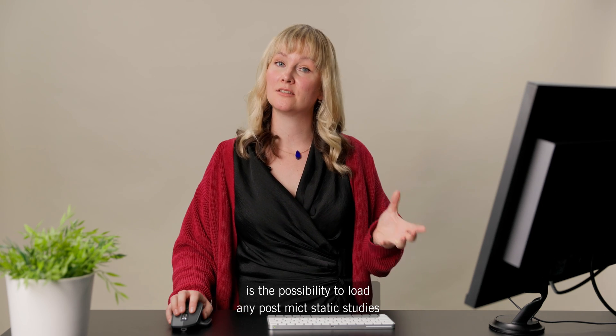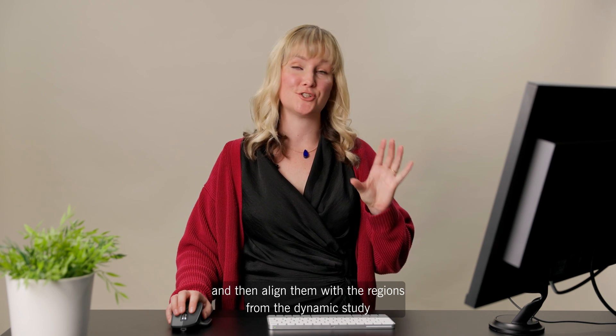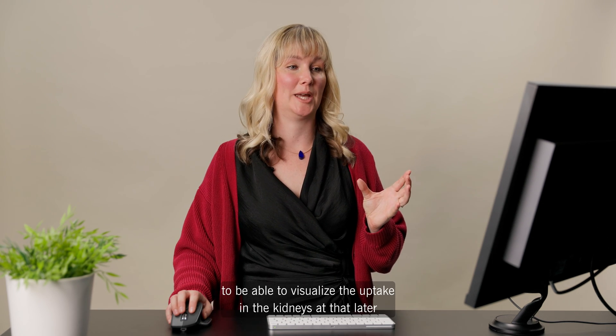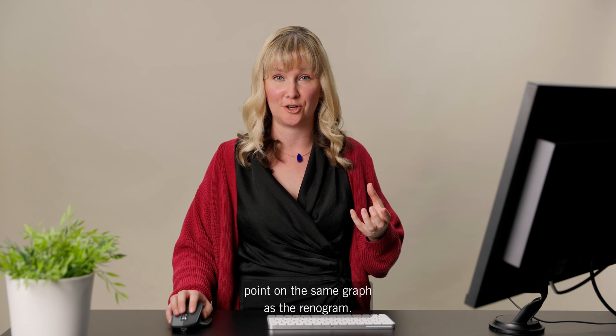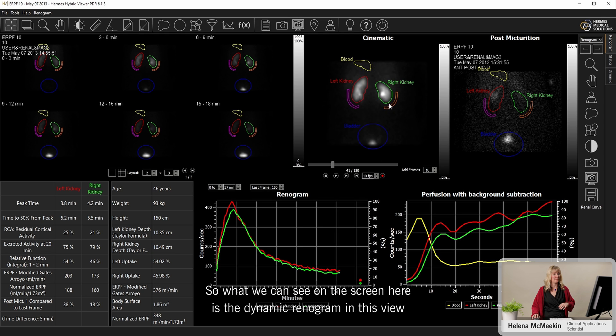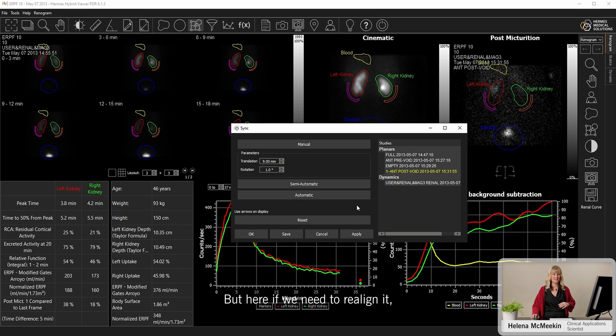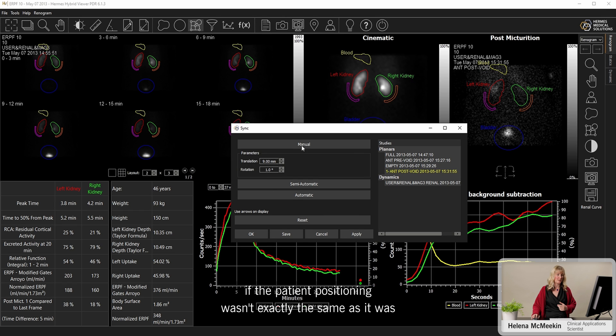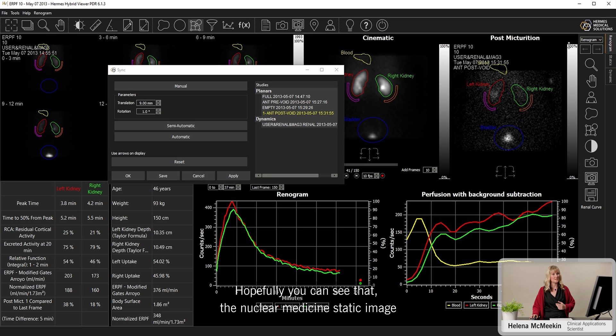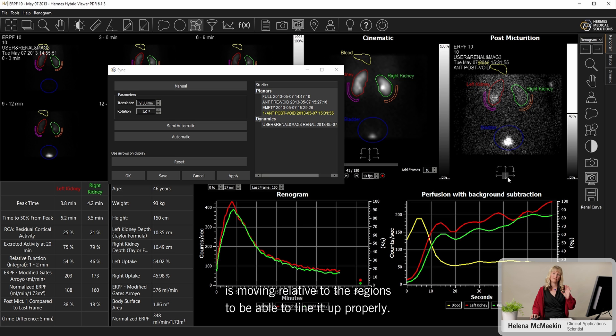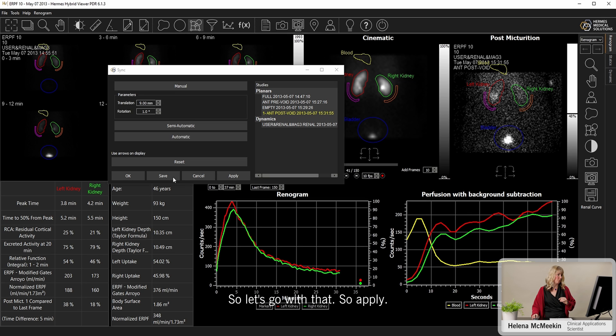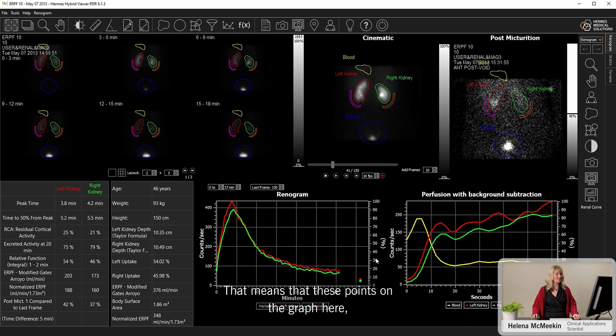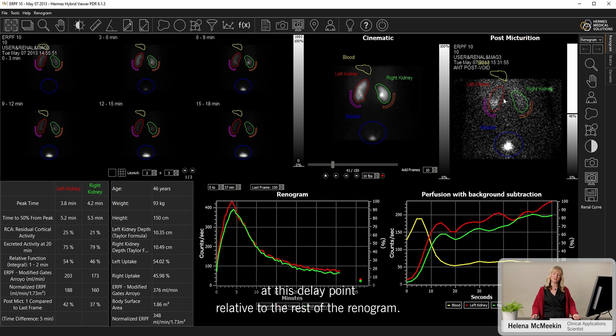A really nice feature of the renogram application is the possibility to load any post-mict static studies and then align them with the regions from the dynamic study to be able to visualize the uptake in the kidneys at that later point on the same graph as the renogram. So what we can see on the screen here is the dynamic renogram in this view, and then the transfer of the regions has happened onto the static. But here, if we need to realign it, if the patient positioning wasn't exactly the same as it was for the dynamic portion, we can just use these arrows to move. Hopefully you can see there that the nuclear medicine static image is moving relative to the regions to be able to line it up properly. Let's go with that. So apply and OK. That means that these points on the graph here, which are at the right timing relative to the dynamic portion, are representing the true uptake in the kidneys at this delayed point relative to the rest of the renogram.